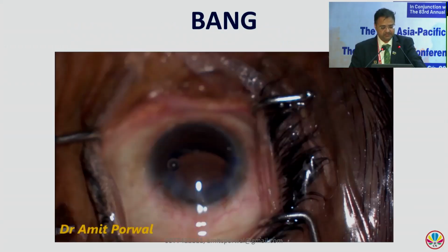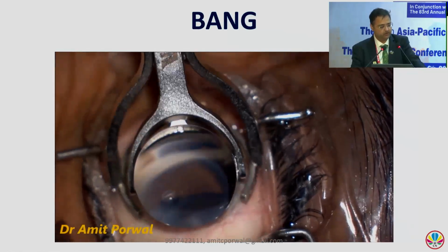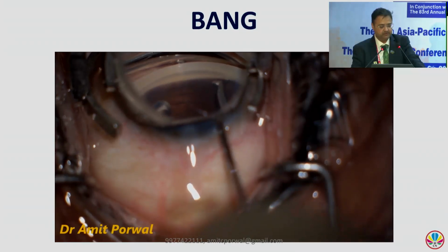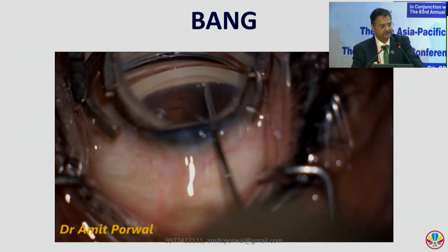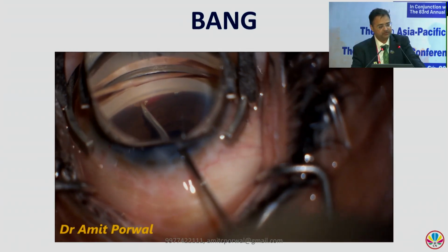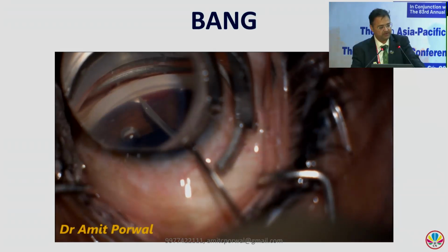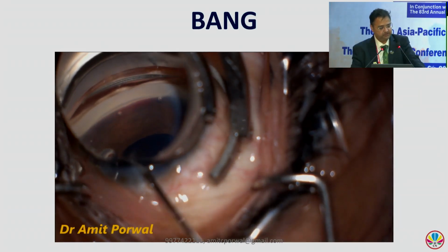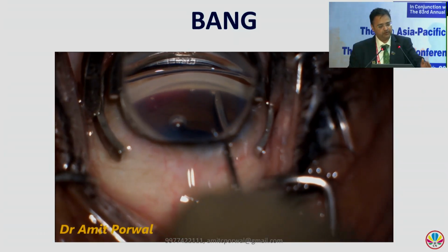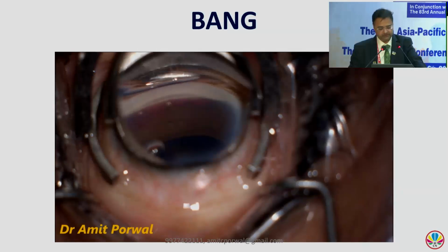Now coming to the procedure, as I told you, you should always practice gonioscopy, because if you don't know what you are visualizing, you don't know what you are cutting. So after the cataract surgery, the lens is placed after placing the cohesive visco. First, identify the structures in low magnification, then increase the magnification and excise the trabecular meshwork in one go. Repeated movements should be avoided because there will be more scarring. So in one go, just cut the trabecular meshwork. Reflex of blood means you are in the right plane. So 120 degree goniotomy is done. First start from the center point, go inferiorly, then start superiorly, come back to the center point and finish the goniotomy of 120 degrees.